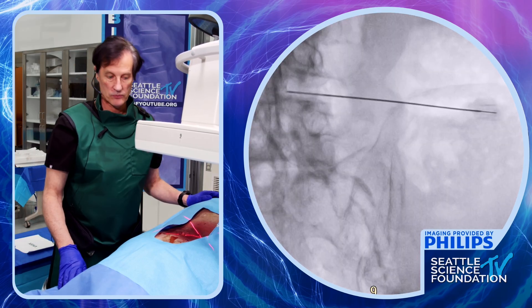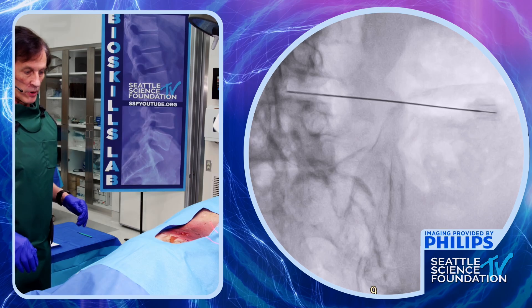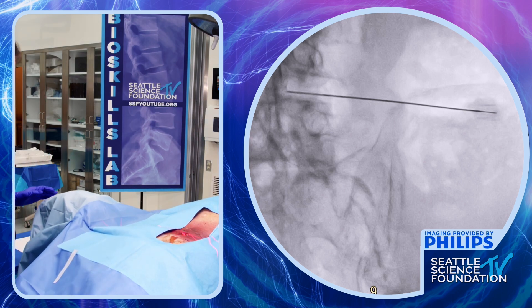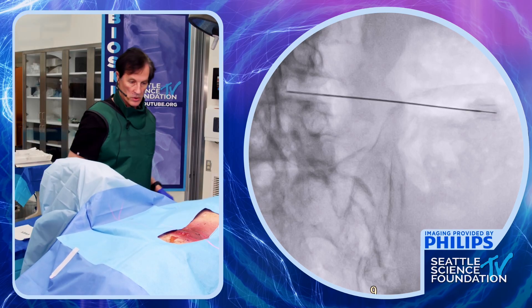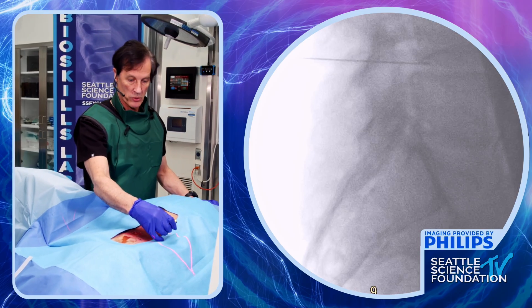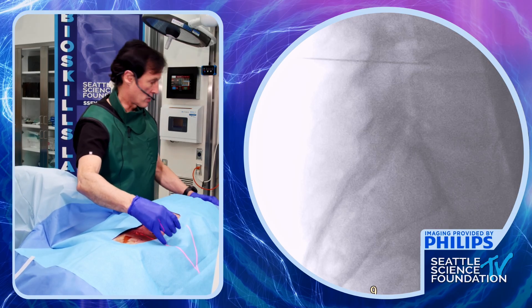Let's go lateral. We're looking to have it in the center of the disc. Remember, the nucleus pulposus for both types — the nucleus pulposus is the center two-thirds of the disc; it's really the center third that we're aiming for. Bring it down. Advance it in — we're not quite centered in the x-ray here, so drop it down, bring it superior.